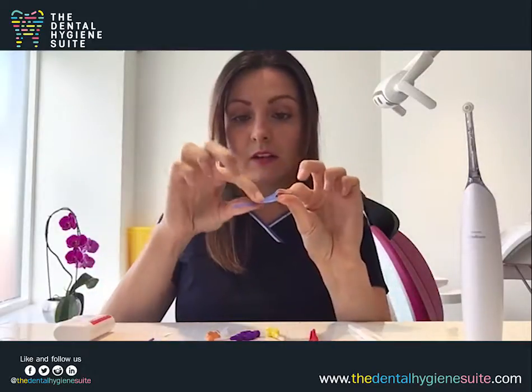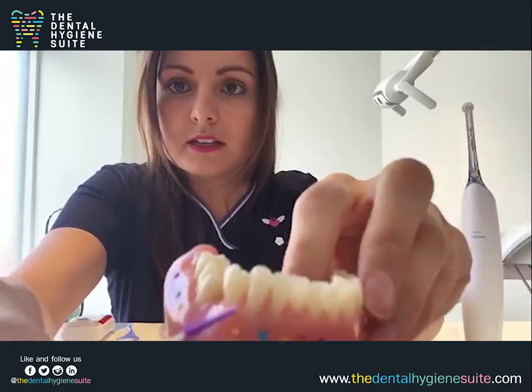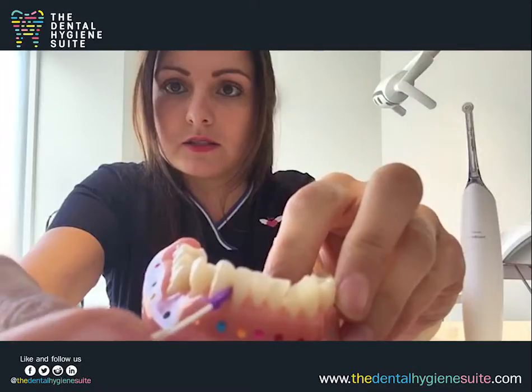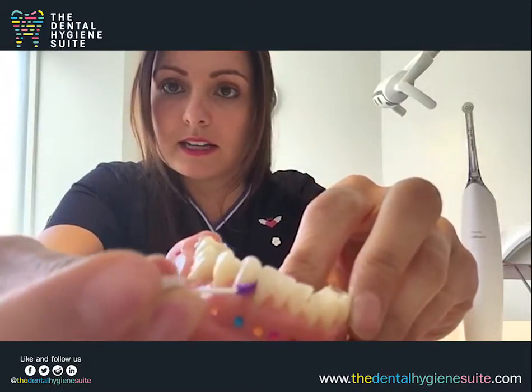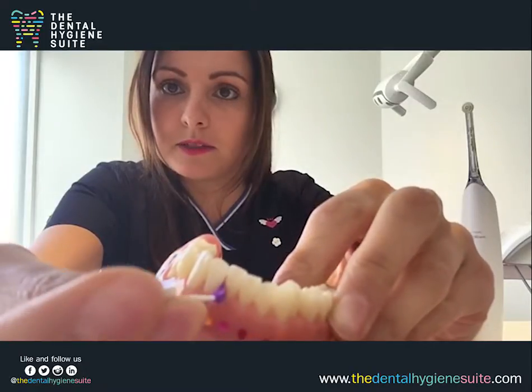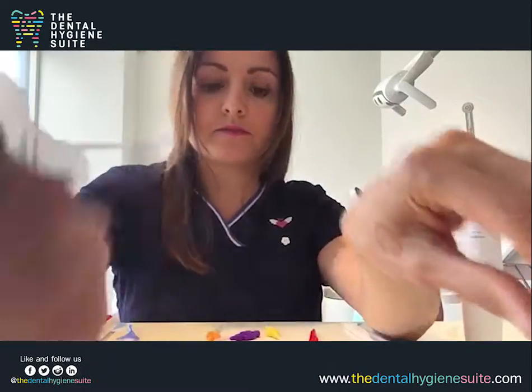If you don't like the stringy floss, we have got the floss harps. These are on a sort of handle, so really good for those big back molars. We've also got these little rubber sticks. These are lovely and flexible, okay? And I'm just going to show you on the model. So if I just demonstrate, it just goes in at the base of the gum, give it a really good scrub either side, just like that, and then you can go in the next gap as well. And you just go around all the gaps, really quick and easy to use.